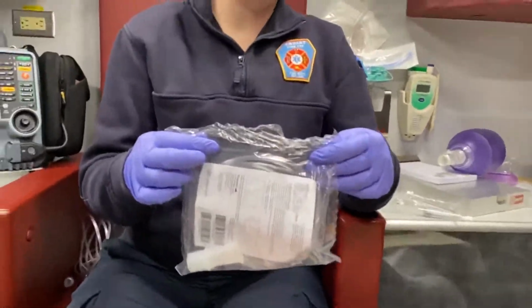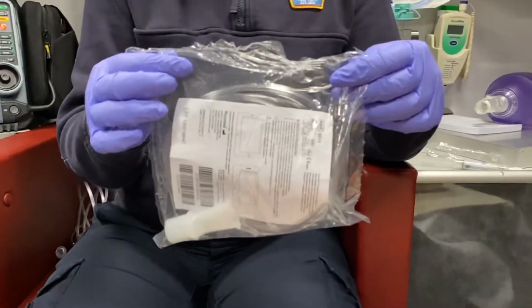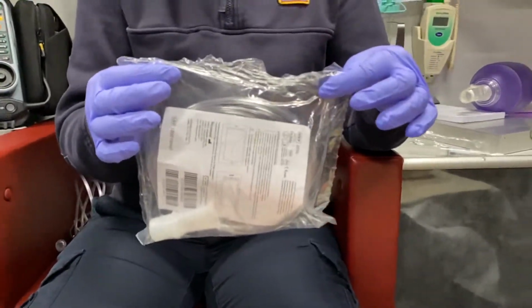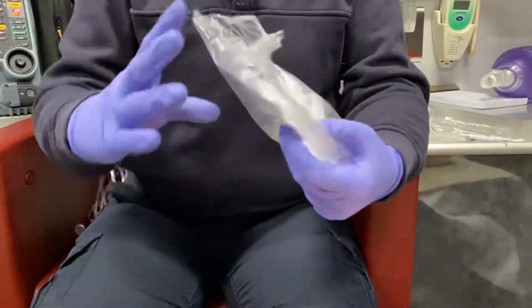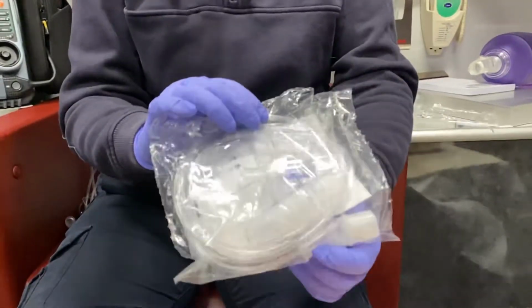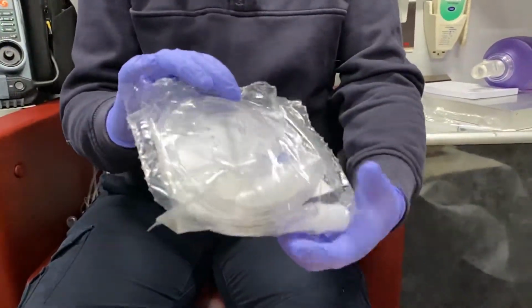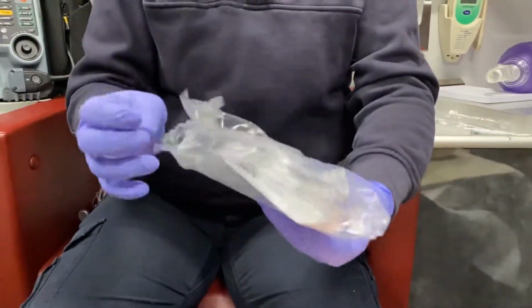All right, next we'll talk about our nebulizer treatments, and I'm just going to demo how to set up a nebulizer. I'm only going to be nebulizing saline in this because I don't want to utilize any medications. So your nebulizer comes in a kit where you have all your pieces, and you do have to put this together prior to giving it to your patient. There's also a mask connector that you can use with this, but it's packaged separately.